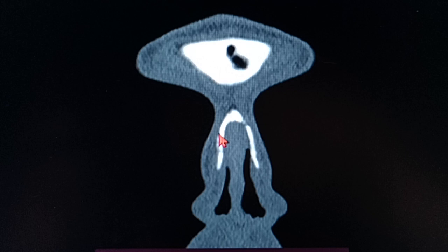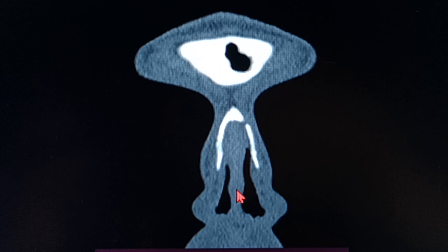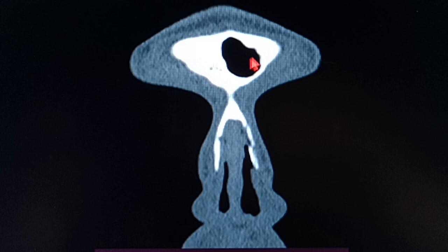And you can still see the nasal bone, but now it's becoming longer. It is elongating on both sides, and this will eventually form the frontal process of the maxilla. I'll tell you how. So I'm going behind. You can still see the cartilage of the septum. You do not see any perpendicular plate of the ethmoid so far. Going behind, what you can see right now is a huge pneumatization on the left side. On the left side, this should ideally be a frontal sinus.